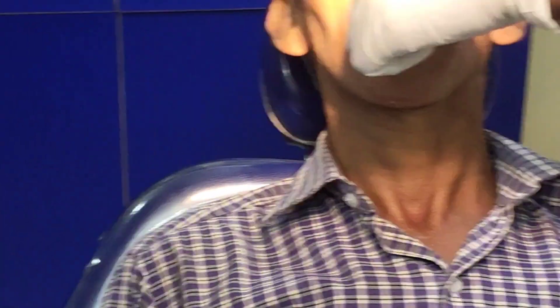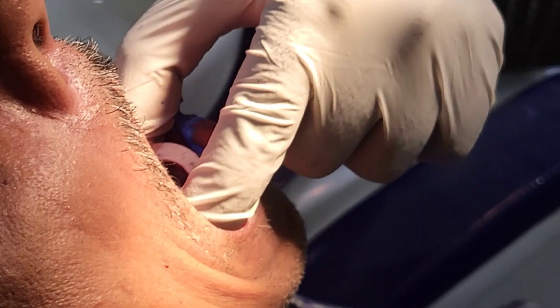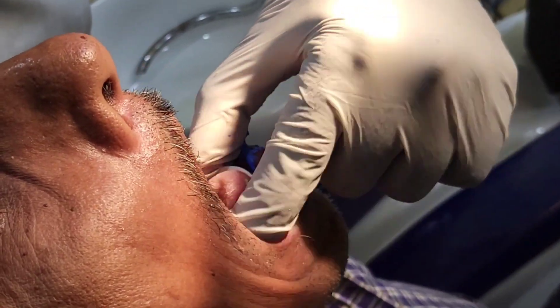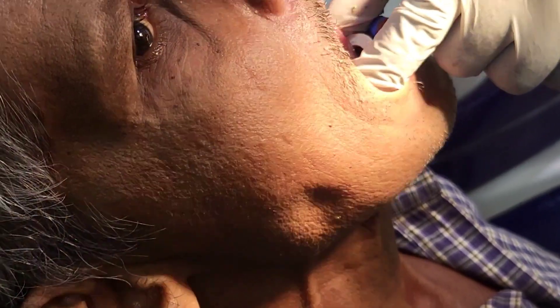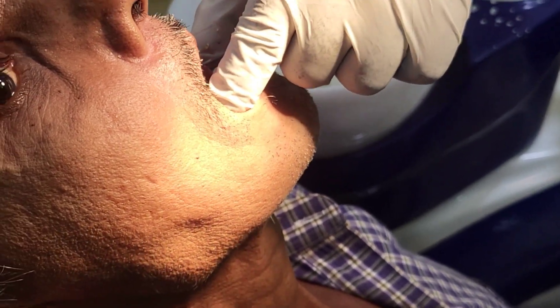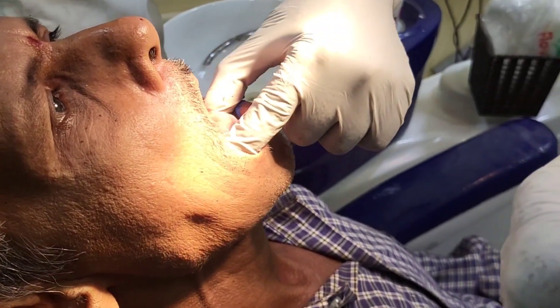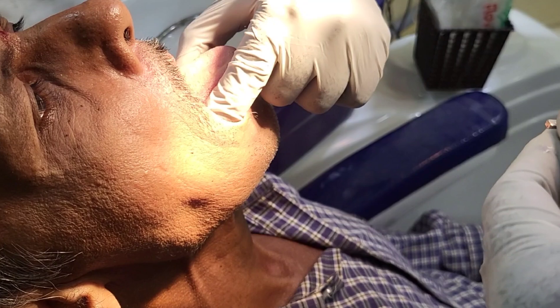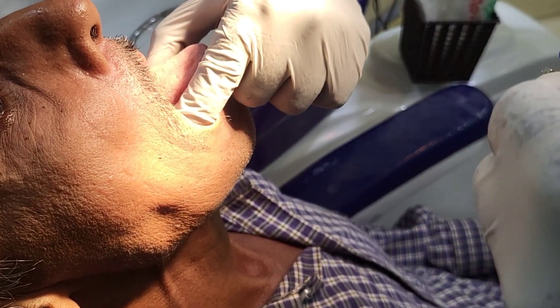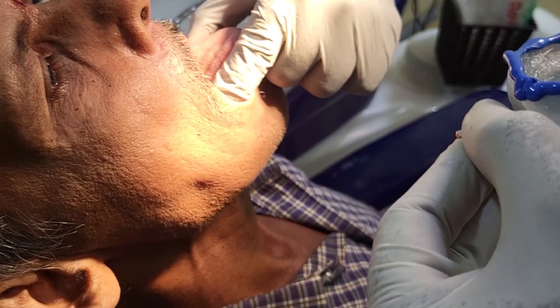Since it is a single step border molding procedure, you need to ask the patient to do all the movements simultaneously. Ask the patient to lift the tongue outside, then move right and left, and use the tongue to touch the inner surface of the cheek on the right and left side. These movements should be done simultaneously twice or thrice.